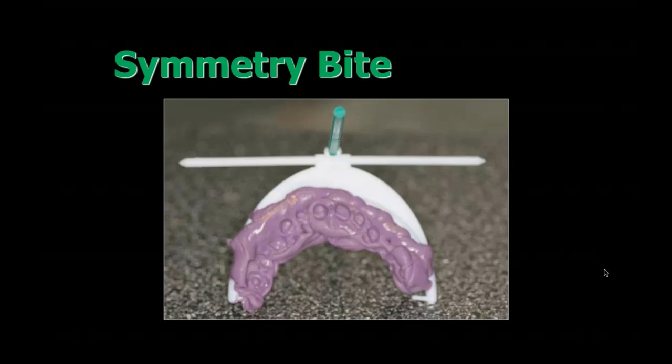I'm going to go here to some questions. Can you explain how you do the quadrant pickup with the last full arch case? So when I took the full arch impression, I had a distortion of that second molar. All I did was take a quadrant tray and put light body, and my assistant put tray material in there, and I just seated it. First of all, I try the tray in because we all know that quadrant trays can get distorted. When I seat that, I hold it with my hand. I don't let the patient bite on a cotton roll. I hold that for the whole 3.5 to 4 minutes.